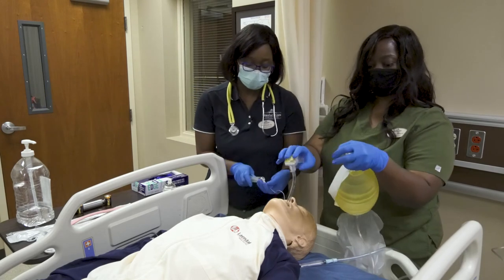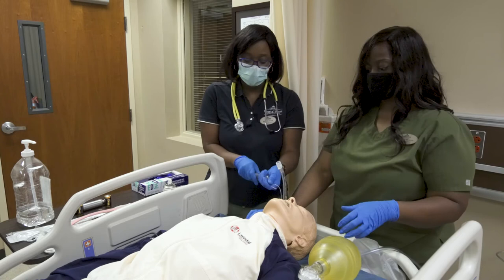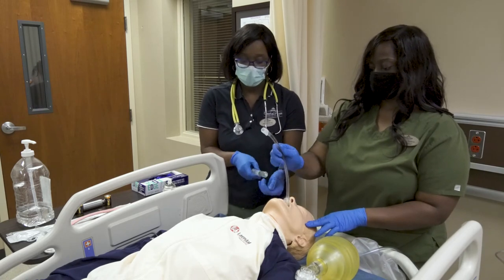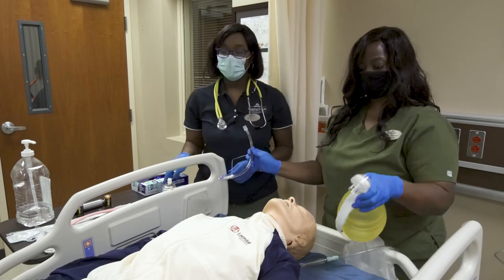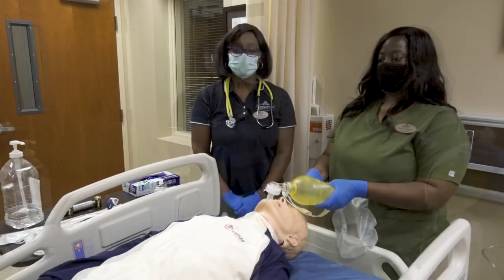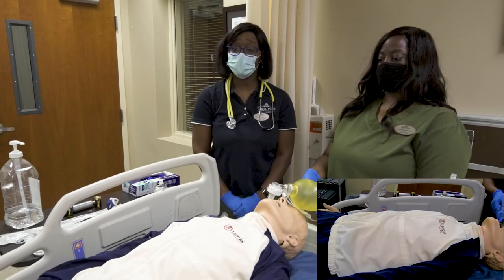If you hear sounds in the epigastric area, you will stop bagging, deflate the cuff, remove the endotracheal tube, and redo the procedure again.